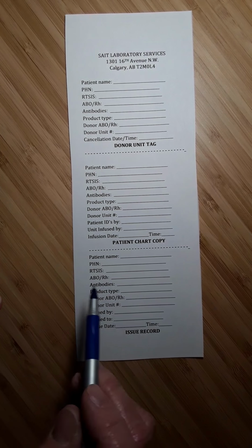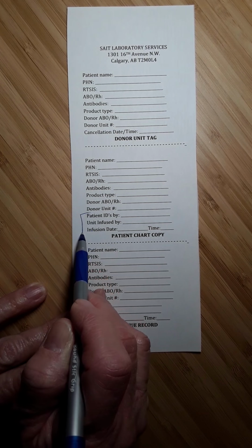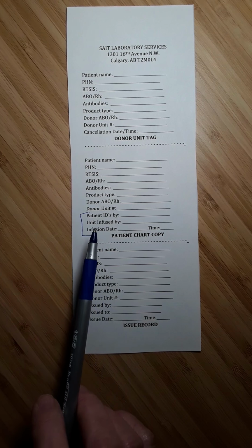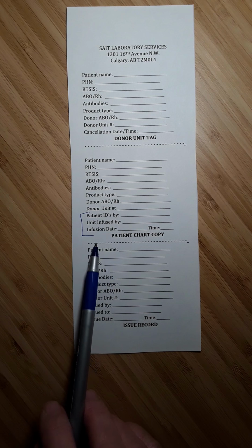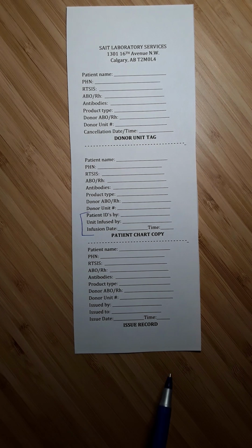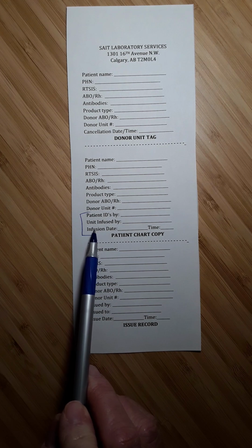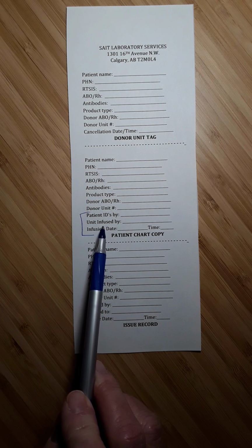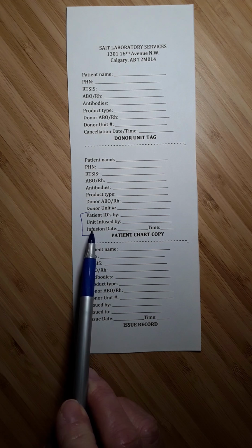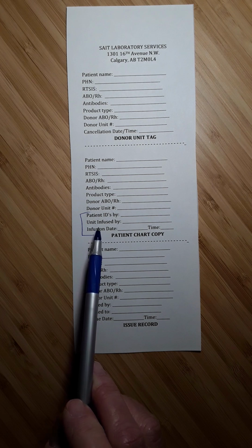The middle portion of the tag, there will be a section here, patient ID'd by, unit infused by, and the infusion date and time. This is not for us to fill out, okay? We are not infusing the blood product. To infuse the blood product means to physically give the blood through an administration set and into the arm of the patient. And we're not doing that.